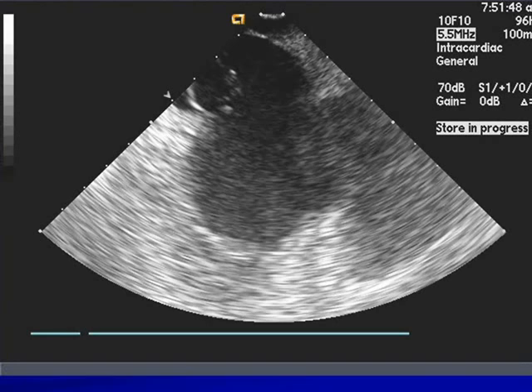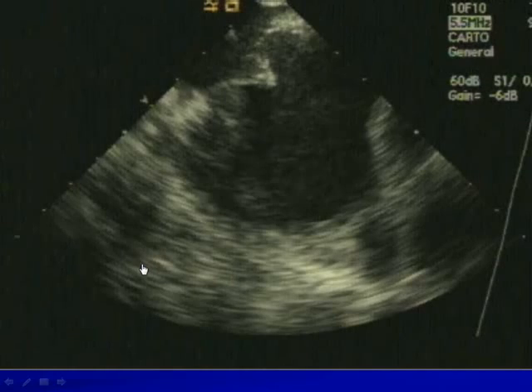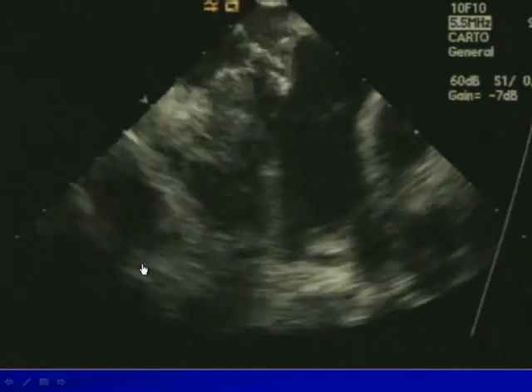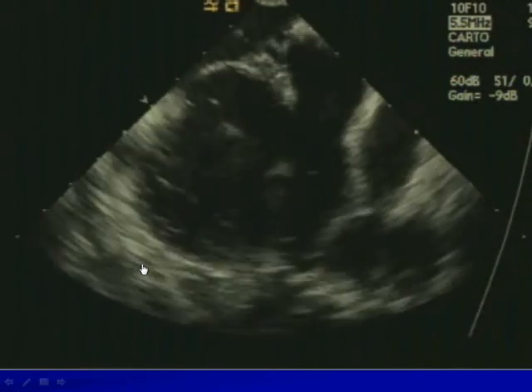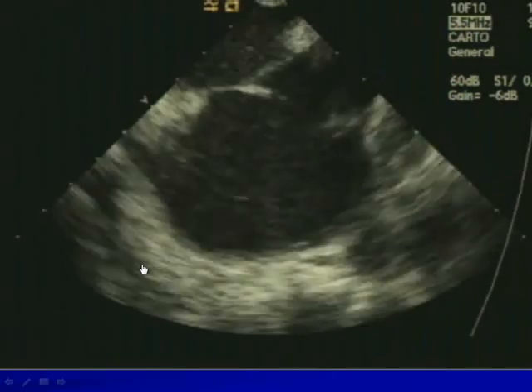This is an aneurysmal interatrial septum. As you can see, this patient's left atrium obviously had higher pressure than the right side, so the septum was really bowing into the right side. What you're looking at here is the interatrial septum right here. There's a transseptal needle right here, and a little bit of energy was delivered right down. That's what you saw, those what appeared to be bubbles there as they were going across.